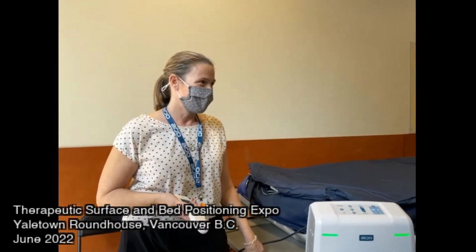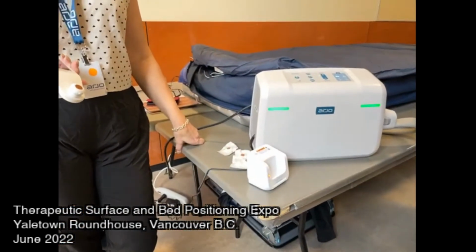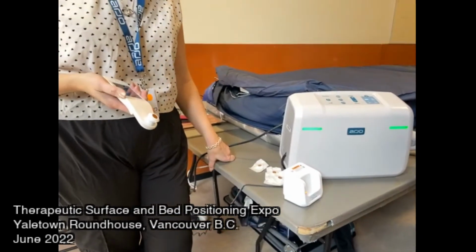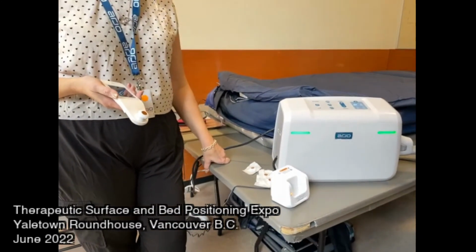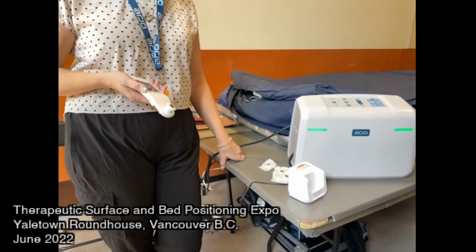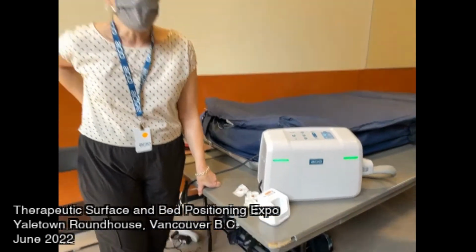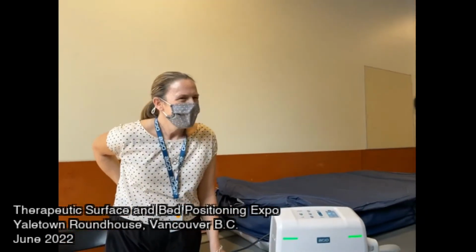Any questions? This would be so good for people who are independent. I'm thinking of spinal cord injuries, who really want to monitor and take control over their own care. They can't see their sacrum, they can't feel their sacrum. Yeah, exactly, if they have the ability to do so.